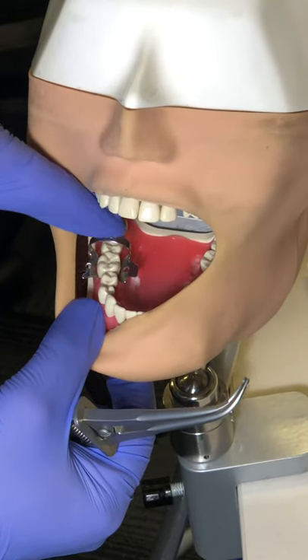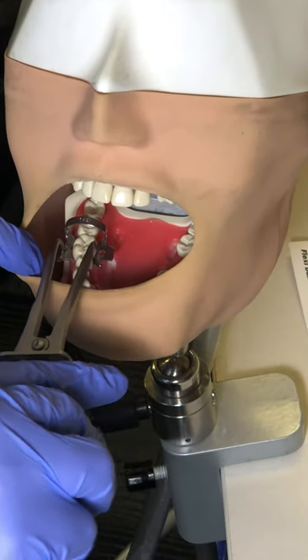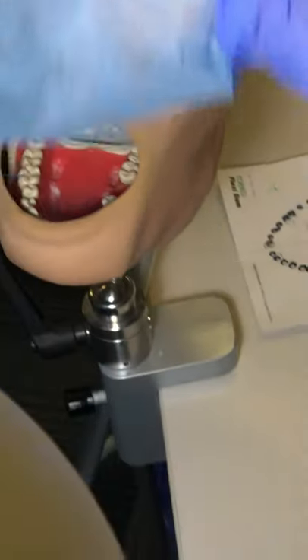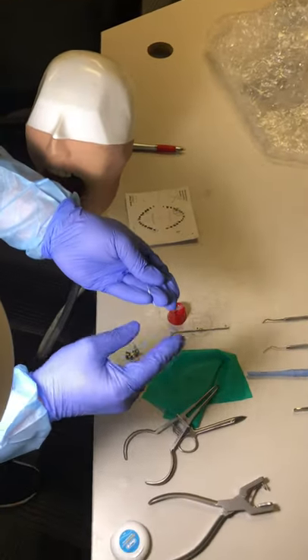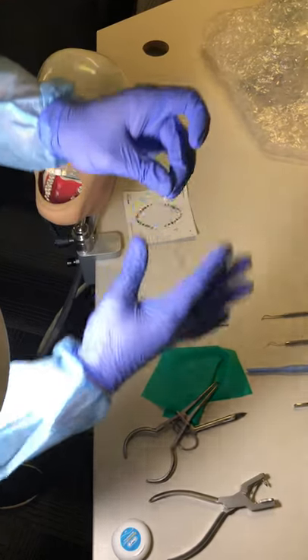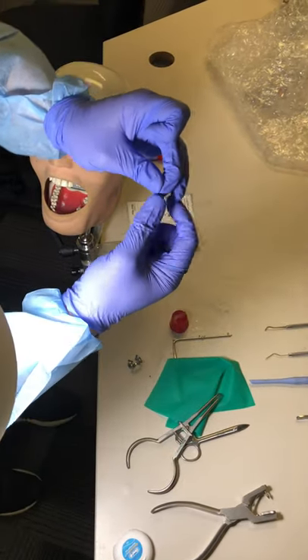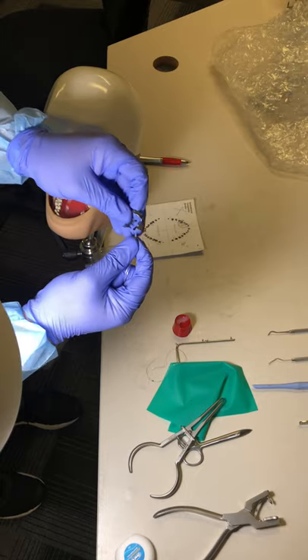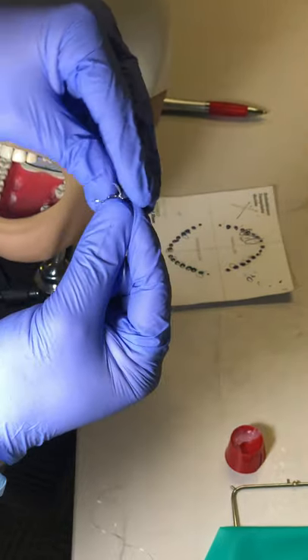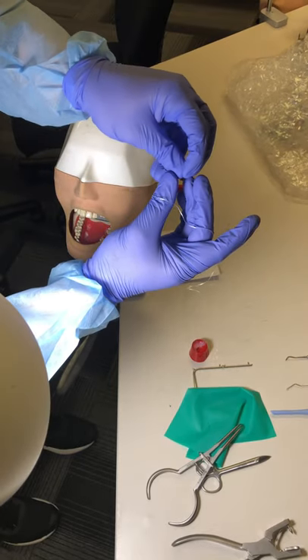Once we're sure it's stable, we push it from the bow to confirm stability, then remove it and make the tie — this needs to be quick and comes with practice. First, make the two ends together to form a loop. Then take the two ends and insert them from the lingual or palatal part if it's the upper arch, and get them inside the loop.